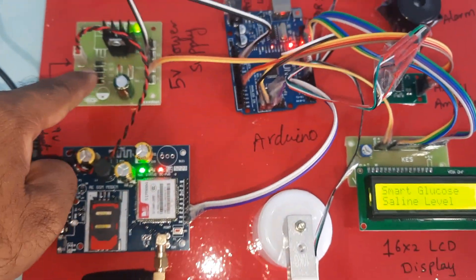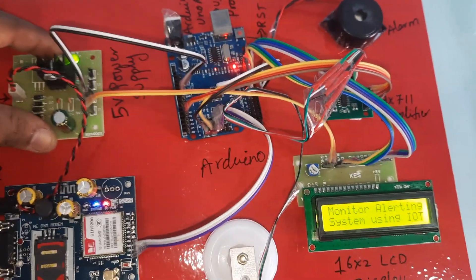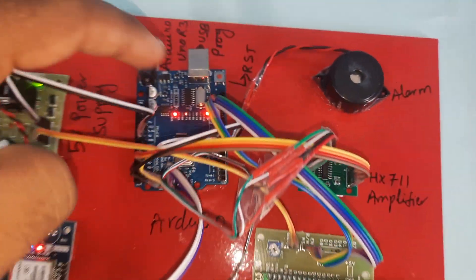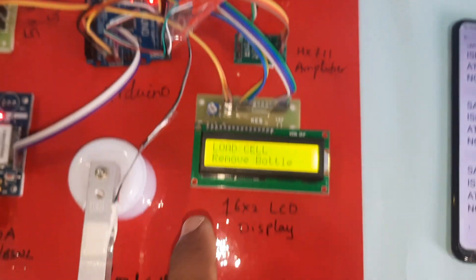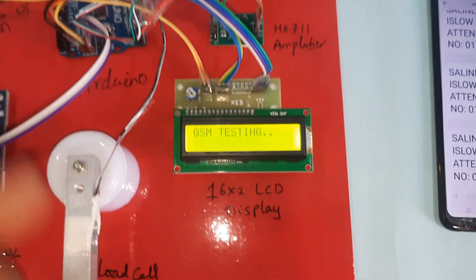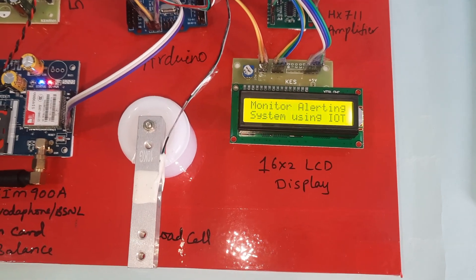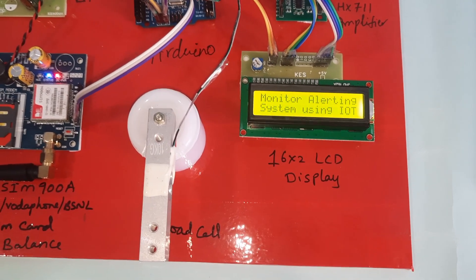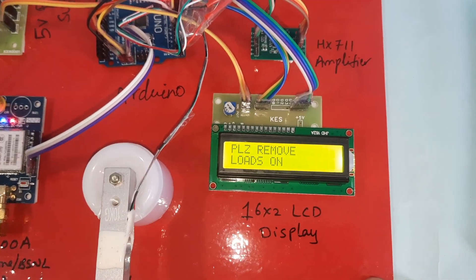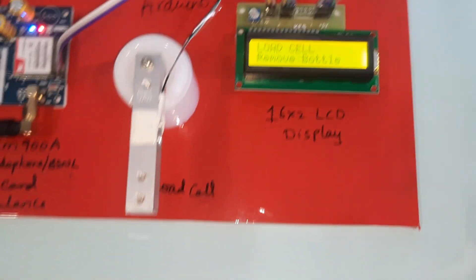The power supply module includes a bridge rectifier, filter capacitor, 7805 regulator, and LED, providing 5 volts to the Arduino Uno R3 board and 16x2 LCD display. Now pressing the reset button — the LCD shows: 'Smart Glucose Saline Level Monitoring Alert System using IoT. Please remove load on load cell.'